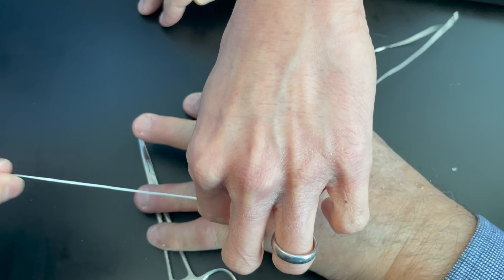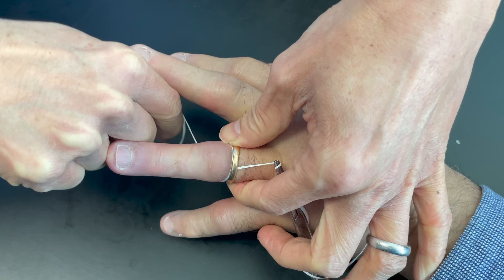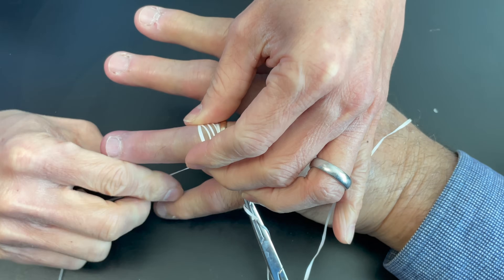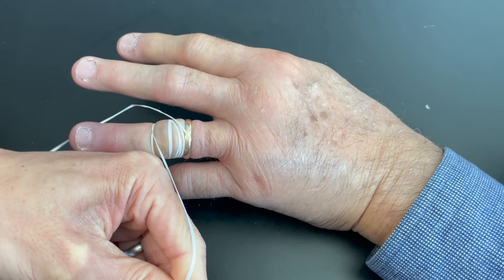The other option in the operating room or emergency room is to use the ring cutter. The problem with ring cutters is that they damage the ring and then the person has to go to a jeweler to have it repaired. Another potential problem is that with these devices there's a little guard that needs to go underneath the ring.